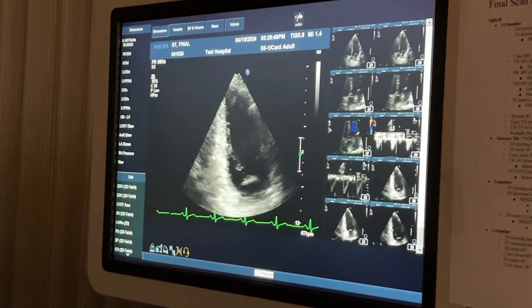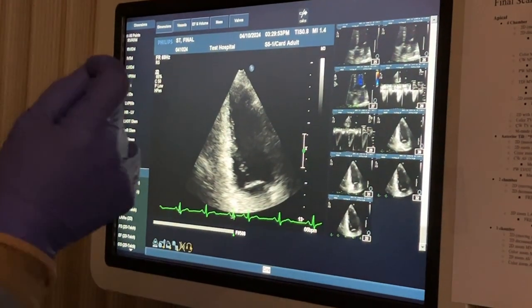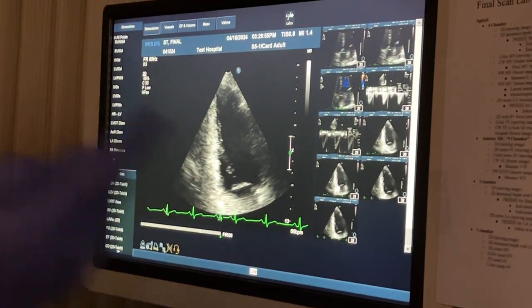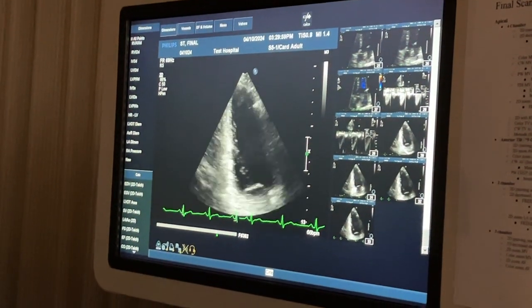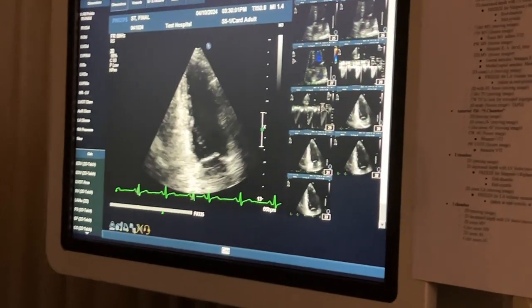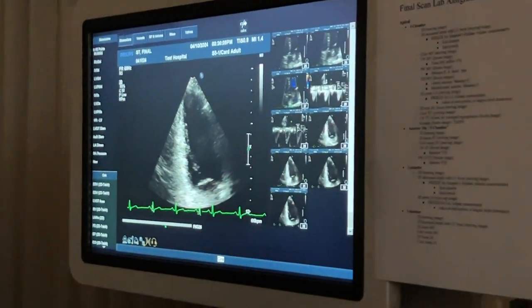When you take a picture, is it going to take a picture of the last 2 that I counted? It's going to take a picture of the last 2 that I counted, and that's what all the machines are set to do. I asked you guys about that at the beginning of class because I feel like that's the best learning tool, to have it set to retrospective capture, and I feel like it's still my preference.